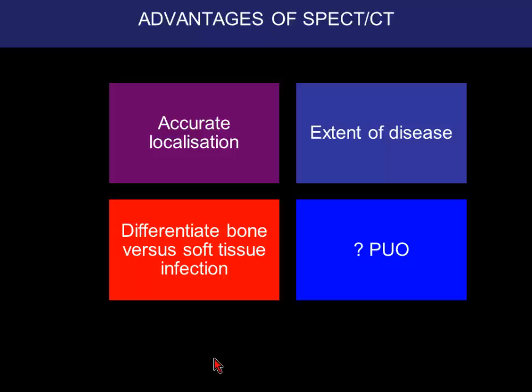That's what I would say, because in all other indications, if it's a pyrexia of unknown origin, or if the patient is an inpatient, if they ask for a white cell scan or anything like that, I would refer them back to have an FDG scan, because it gives a better diagnosis. Do a whole body scan, inject in the morning, and you can get the report in the afternoon or in the evening. Rather than drawing up the blood, labeling it, and injecting, it all complicates the entire scenario.